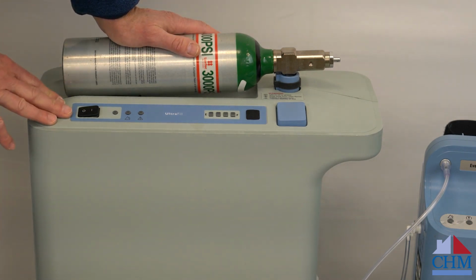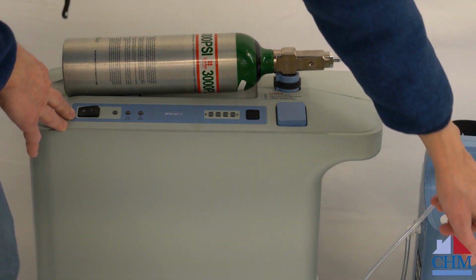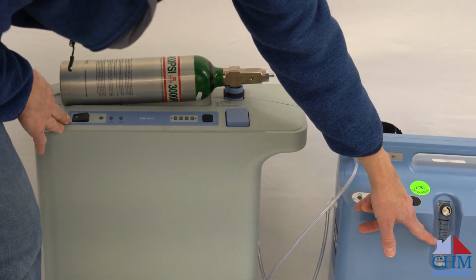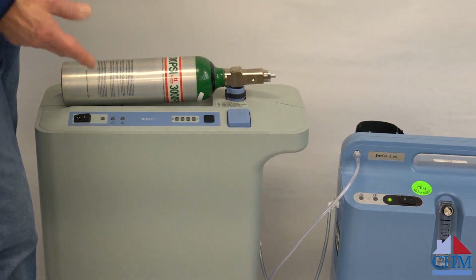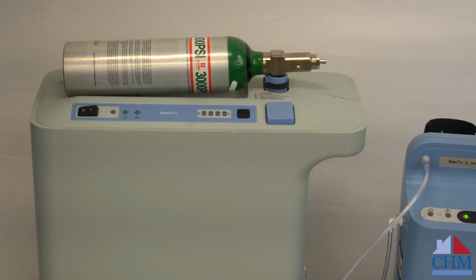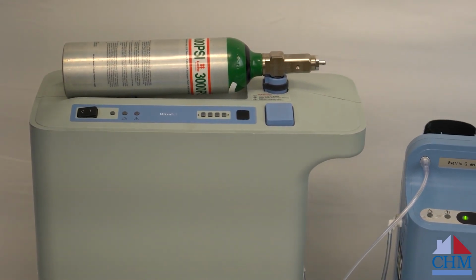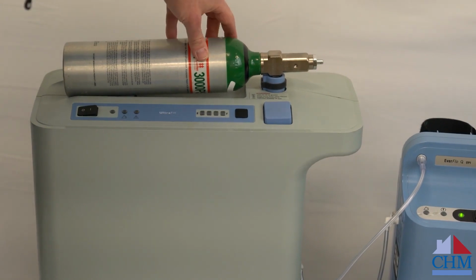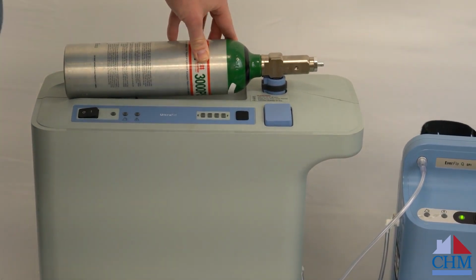Now before I start filling, I'm going to want to make sure, like I mentioned, that the flow gauge is at 3 liters per minute or under. And the reason for that is because the machine can only make so much oxygen. And if we're using more than 3 liters per minute, there's not enough oxygen content left to fill the tank. So right now I've got my concentrator running over there at about 2 liters per minute.